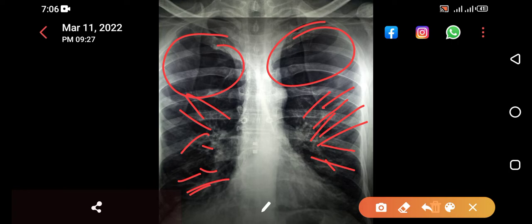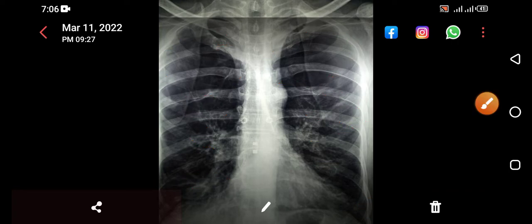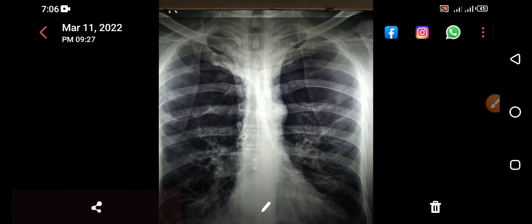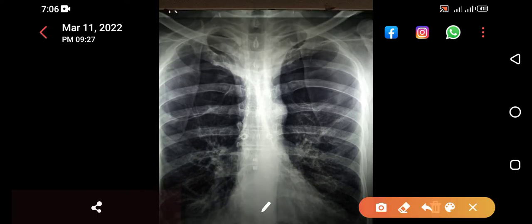With no broncovascular markings, keeping in view the history of smoking and the history of productive cough, there are emphysematous changes present in the lower zones as well as the upper zones, predominantly in the upper zone.